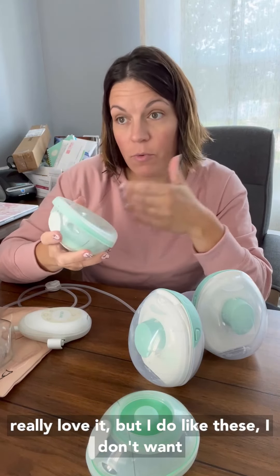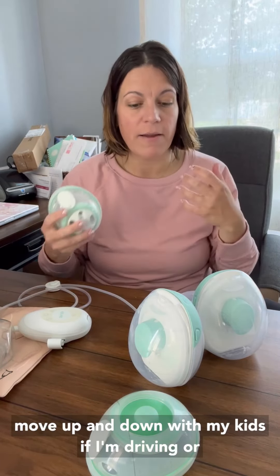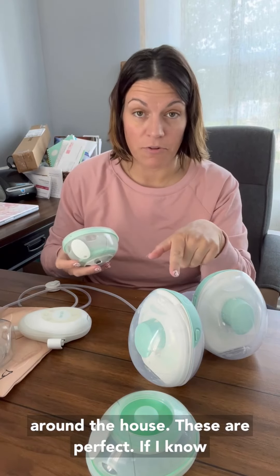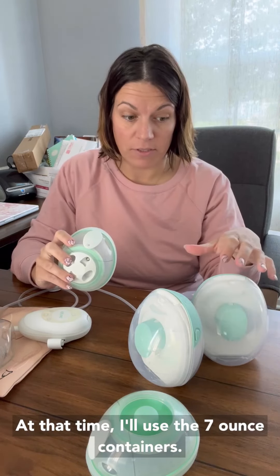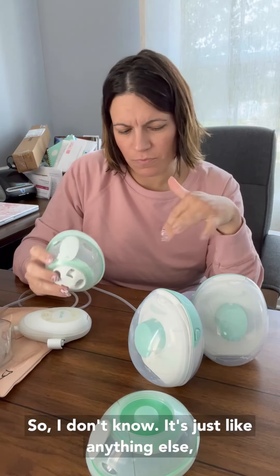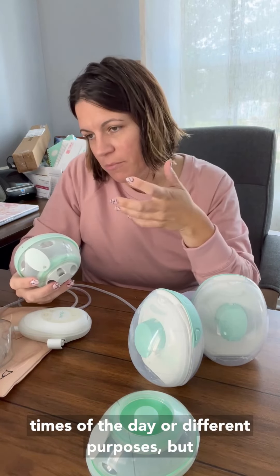I do like these. I used them twice yesterday with my Pumpables Genie Advance because I could get around and move up and down with my kids. If I'm driving or just dilly-daddling around the house, these are perfect. If I know I'm pumping during the day and I expect an elevated supply, I'll use the 7-ounce containers. It's just like anything else — there are better pumps for different times of day or different purposes.